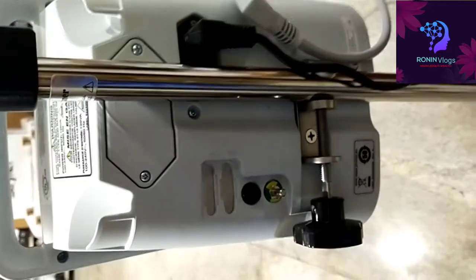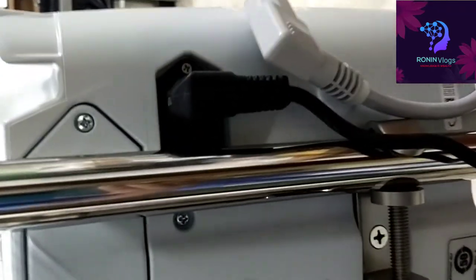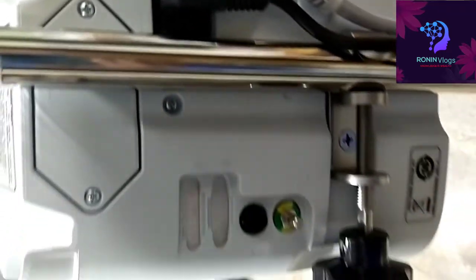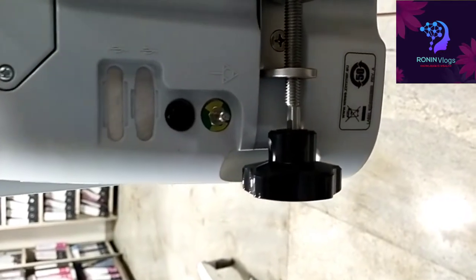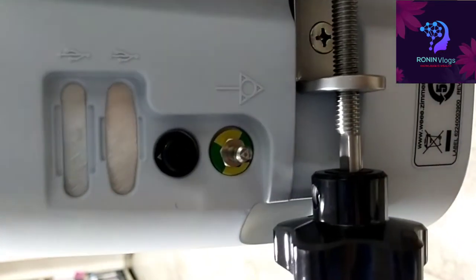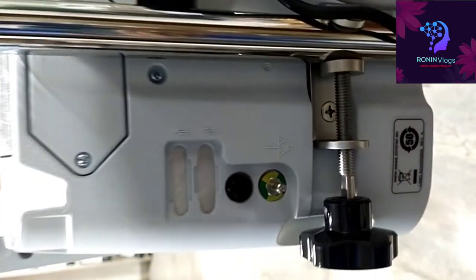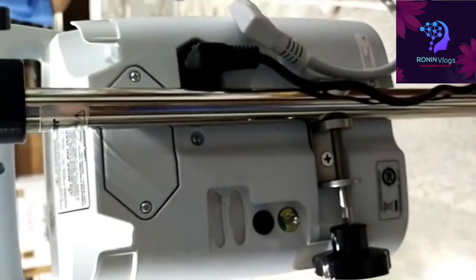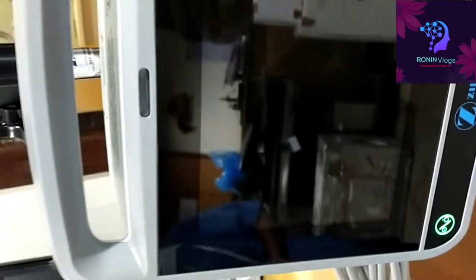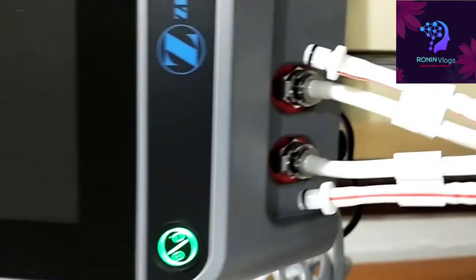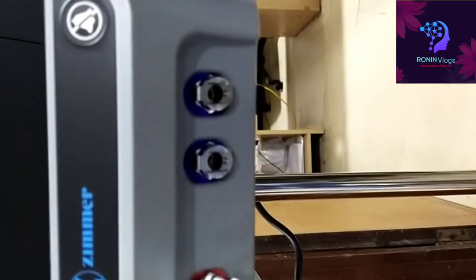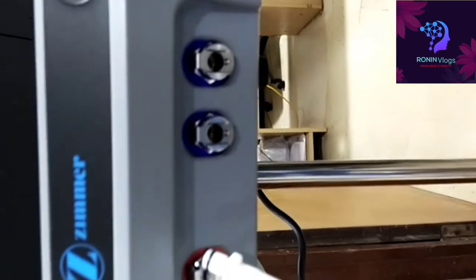So backside, this is the backside. Here we are connecting the power cord, and there is a filter also available, fuse also available. And this is the main screen, it's a touchscreen, and here we connect to the cuff. At a time we can use two cuffs, that is a specialty.